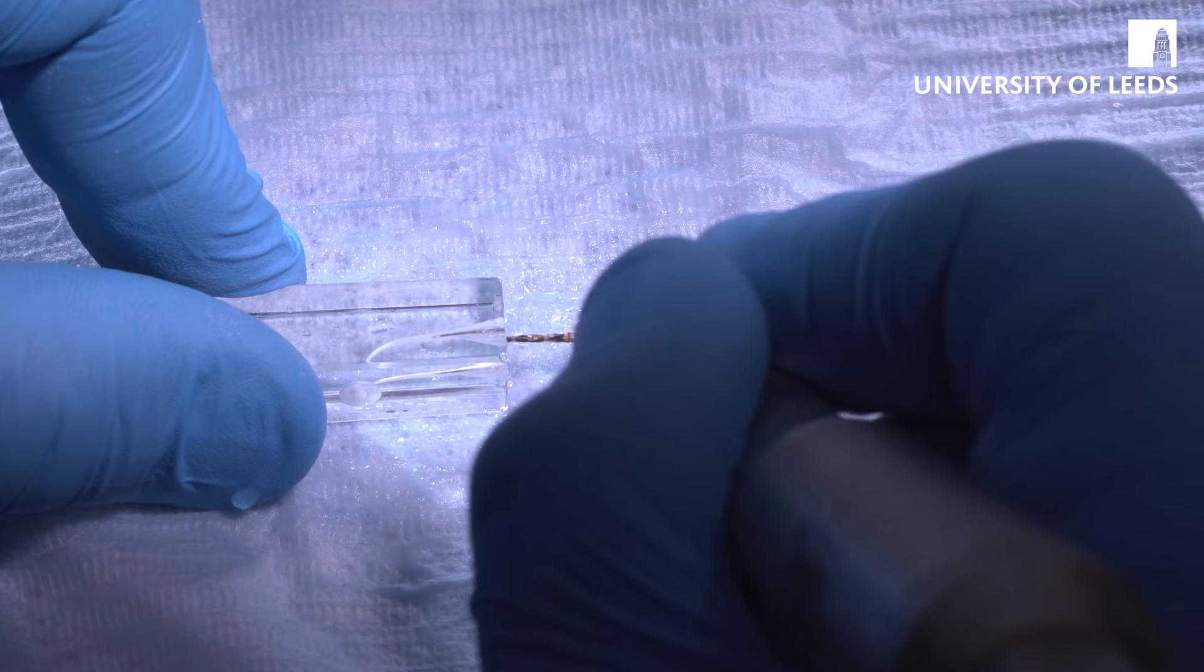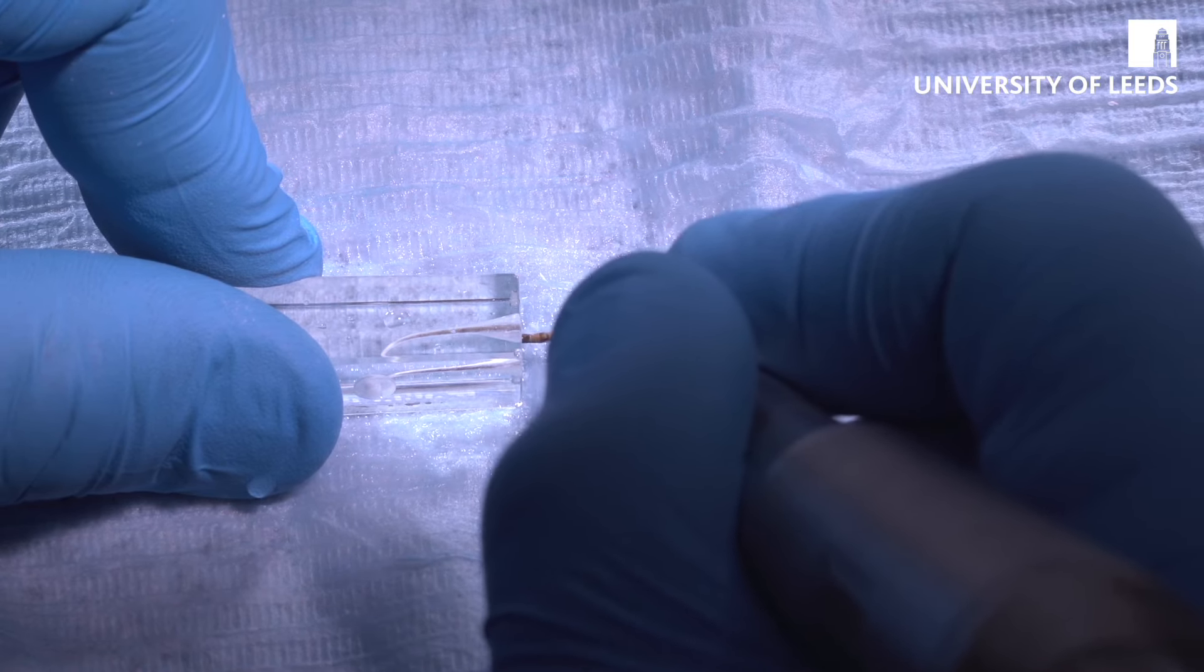Three passes, irrigate, patency file, and then put back in again. And this time it should go almost completely to length, which it does. So now we're going to finish off, so take it fully to length.